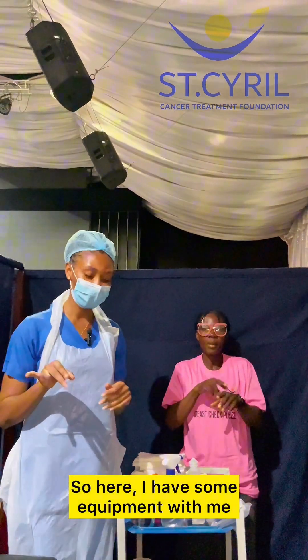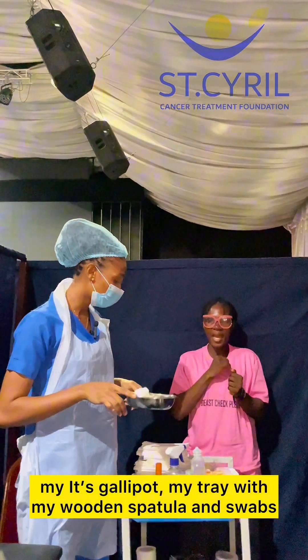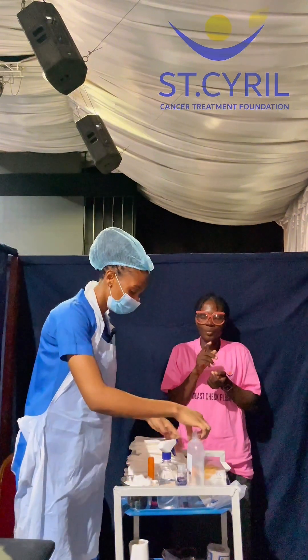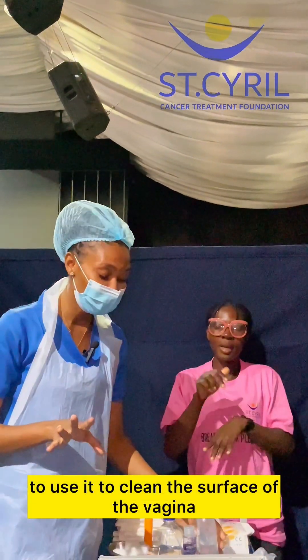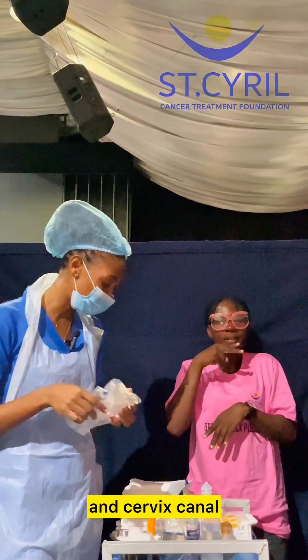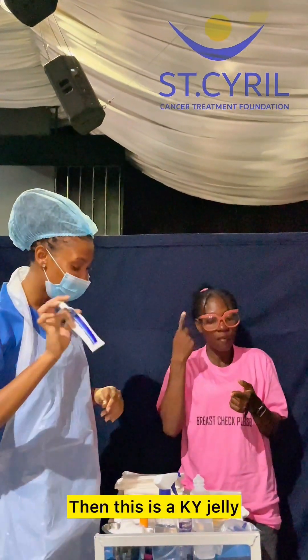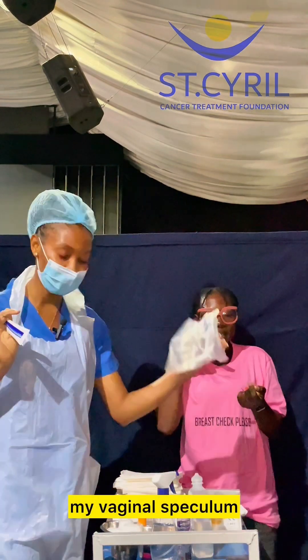So here I have some equipment with me. I have my gully pot, my tray with my wooden spatula and swabs, my normal saline ready to clean the surface of the vagina, and my vaginal speculum for easy access to the cervix and cervical canal. Then this is the KY jelly, a lubricant that helps me to move in with my vaginal speculum.